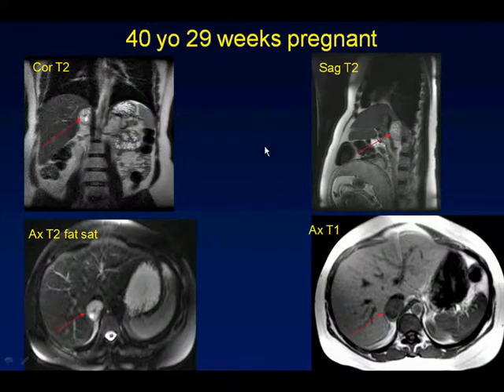So she came to MRI, and with the T1 sequence and the out-of-phase, we didn't see any signal dropout, so we knew it wasn't classic for an adenoma. We didn't see that the lesion was bright. For some of the residents who are taking the boards, on MRI on T1 you want to see if the lesion is possibly bright, because if it's bright, it would indicate macroscopic fat, hemorrhage, or possibly proteinaceous fluid within a cyst.